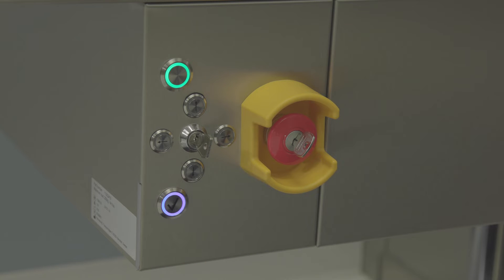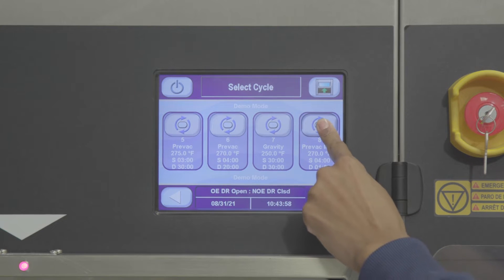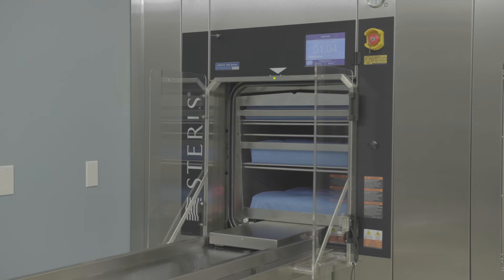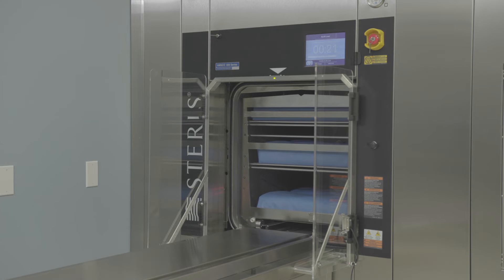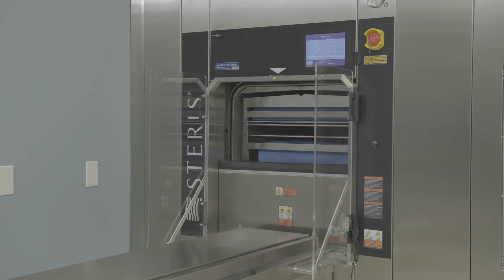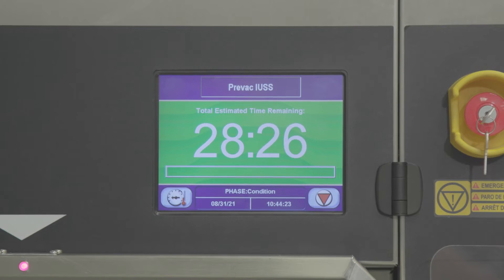An illuminated blue ring around the button confirms activation. Choose the appropriate cycle for the instruments being processed. The load side chamber door opens and the system moves the loading car into the chamber. You'll hear a beeping sound indicating the automatic loading process has begun. Once the chamber door closes, the cycle starts automatically.